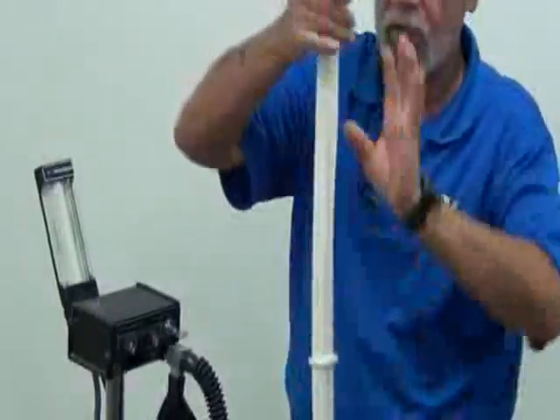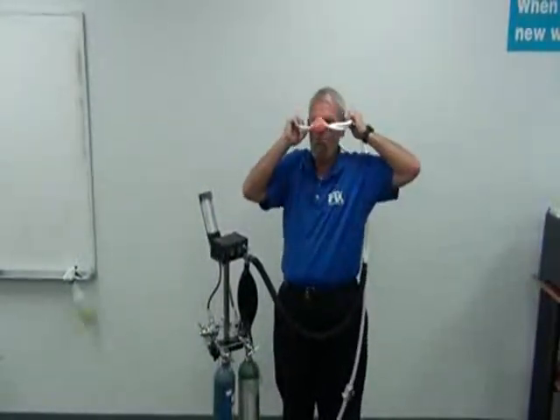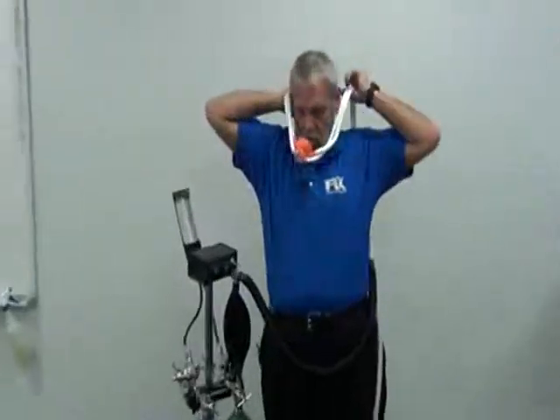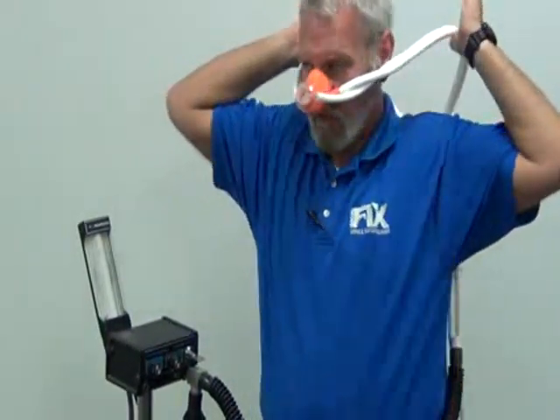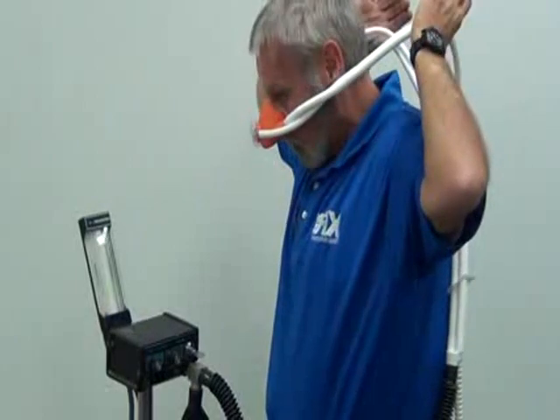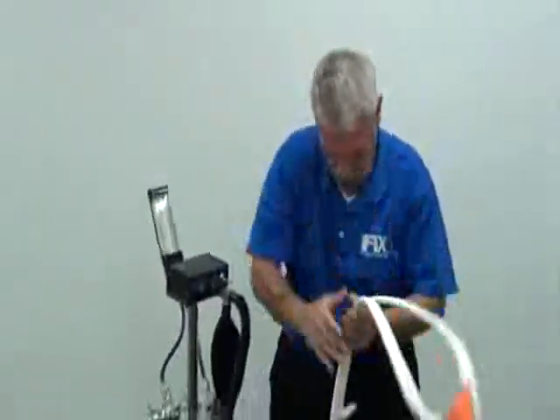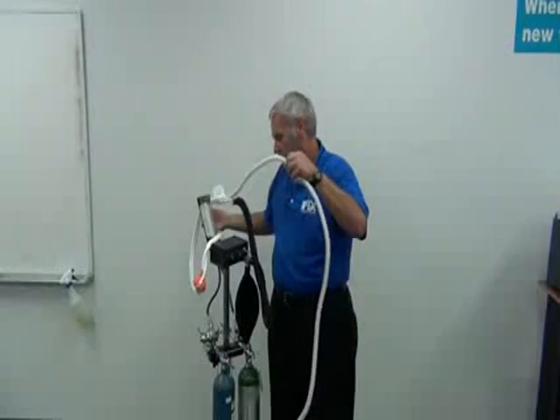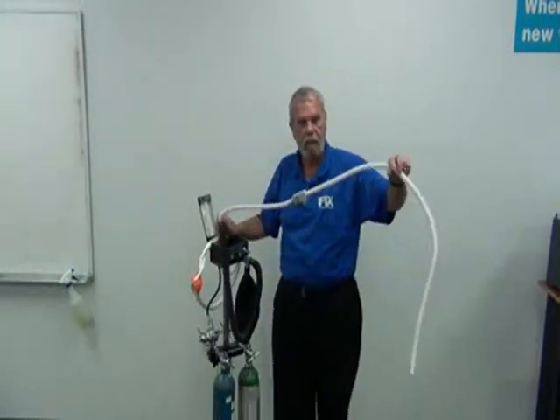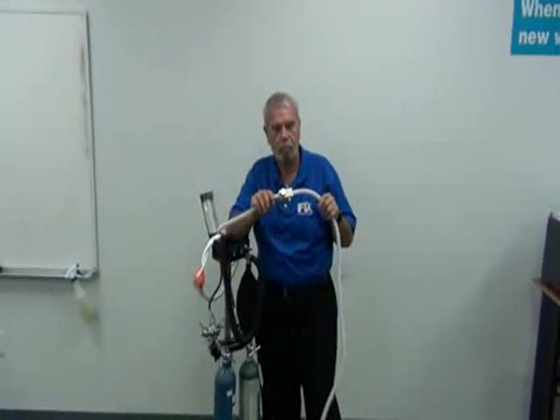Coming off the nose piece, the patient wears the nose piece like this. The doctor comes around the headrest, around the back of the patient's chair, with the patient laying supine so he can still get to the oral cavity. This fits around the headrest of the chair, guys, and comes from the back of the chair, delivering onto the patient. At the end of our rubber good tubing, our nose piece tubing, as you'll notice, we have some corrugated tubing, and we have a gauge on this corrugated tubing.